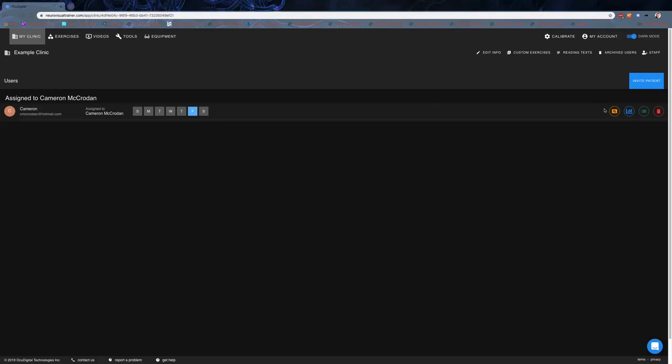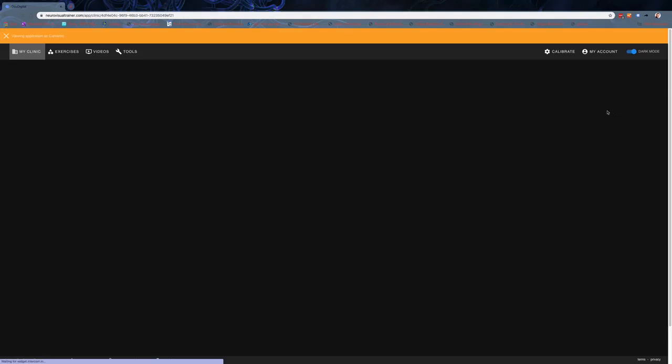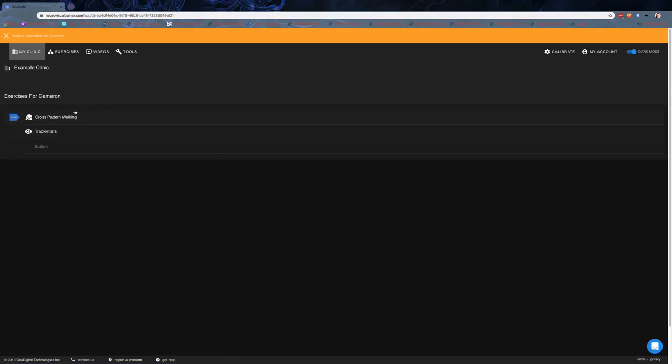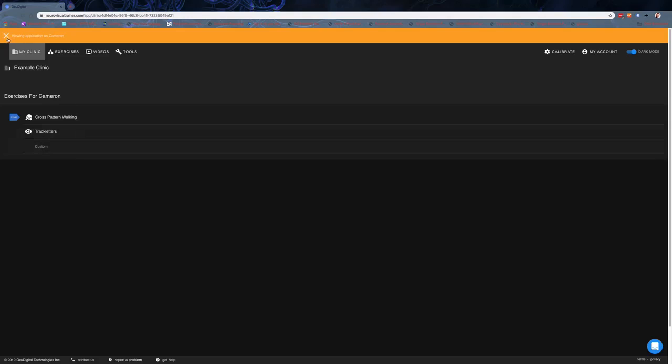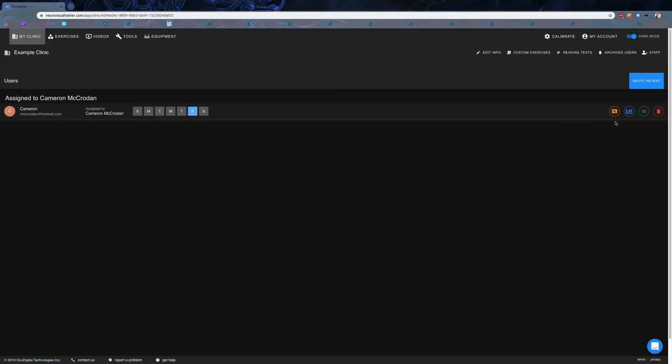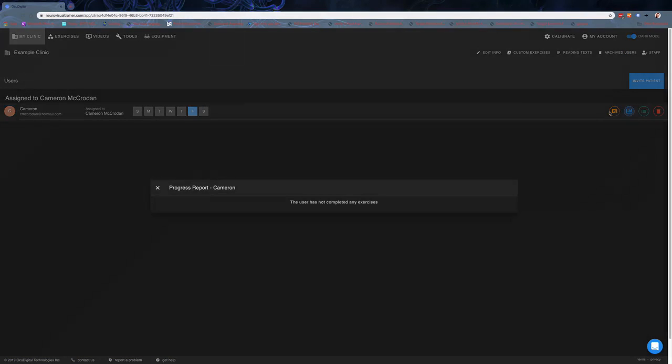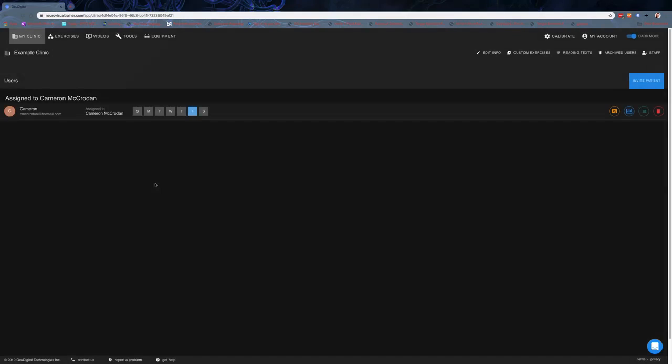The buttons on the right for the patient let you view what the application looks like as that patient. When Cameron logs in, there's a bunch of exercises listed there. As we come back out, you can actually see the progress report. Things like Randot and other stuff with scoring will show up in the progress report. You can see some nice graphs over time.